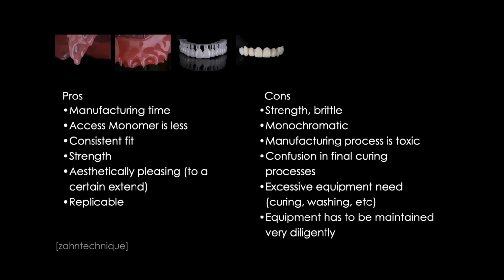But when we have pros, we have also cons, right? And the cons are kind of subjective a little bit, because there are resins coming out that are actually eliminating these cons. So cons usually always say the strength and brittleness. Unfortunately, there are resins out there that are not as strong. They look good, but they're maybe not as strong. They're very brittle, so they can actually break. They're very monochromatic. Usually we don't have resins that show a gradient from a more chromatic to a more translucent area in the tooth, for example. So that's sometimes very difficult, to really print something very aesthetic in terms of color and gradients.